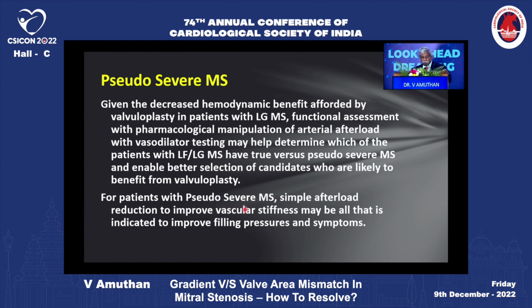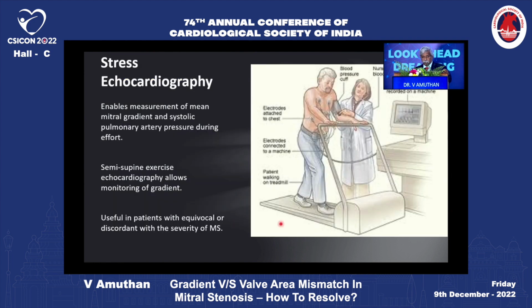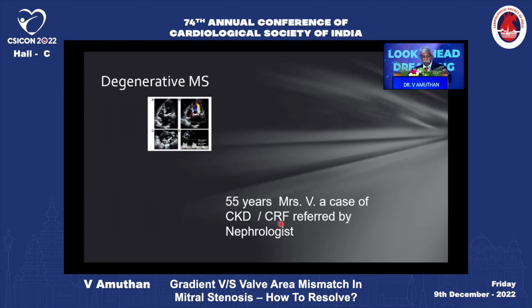For patients with pseudo-severe MS, simple afterload reduction to improve vascular stiffness may be all that is indicated to improve the filling pressures and symptoms. So, stress echocardiography may be helpful.